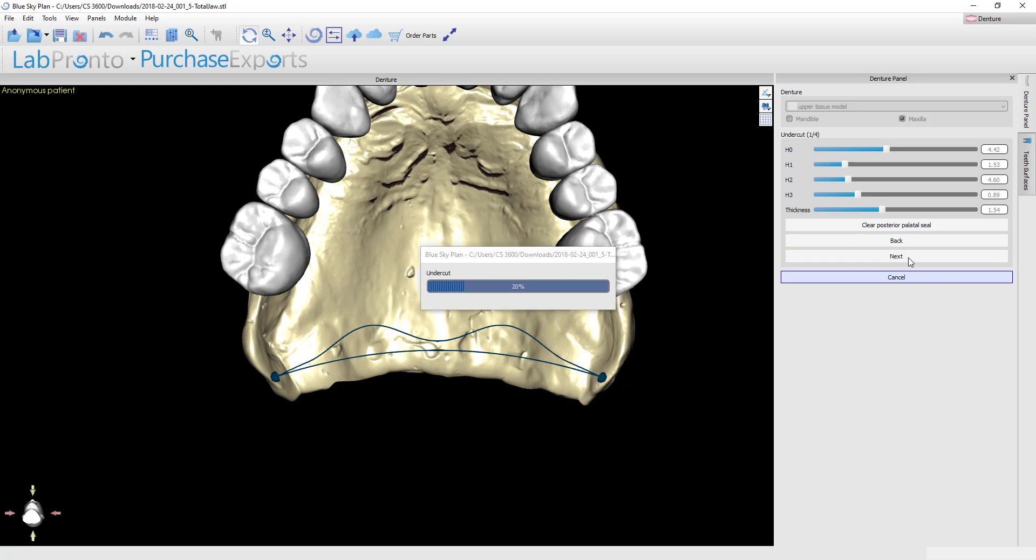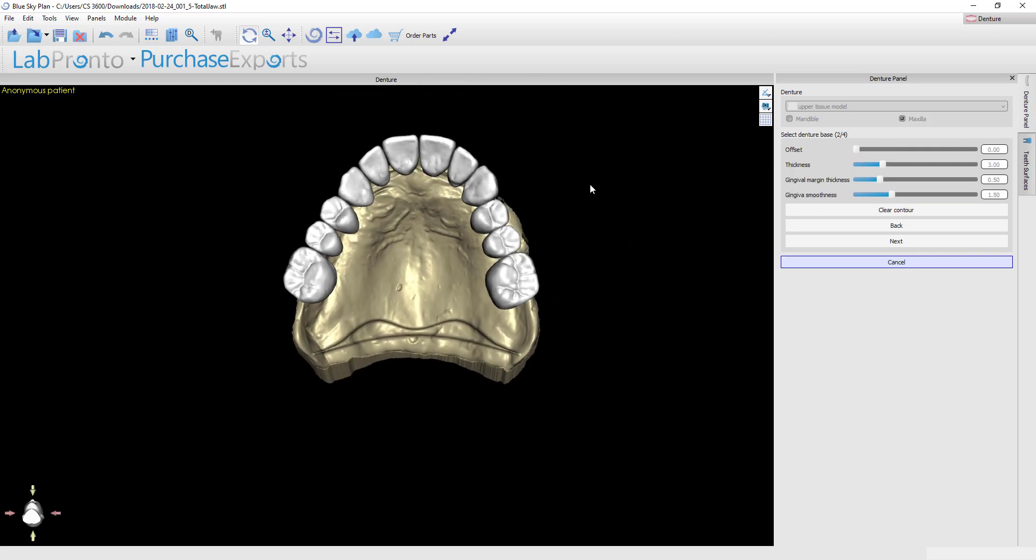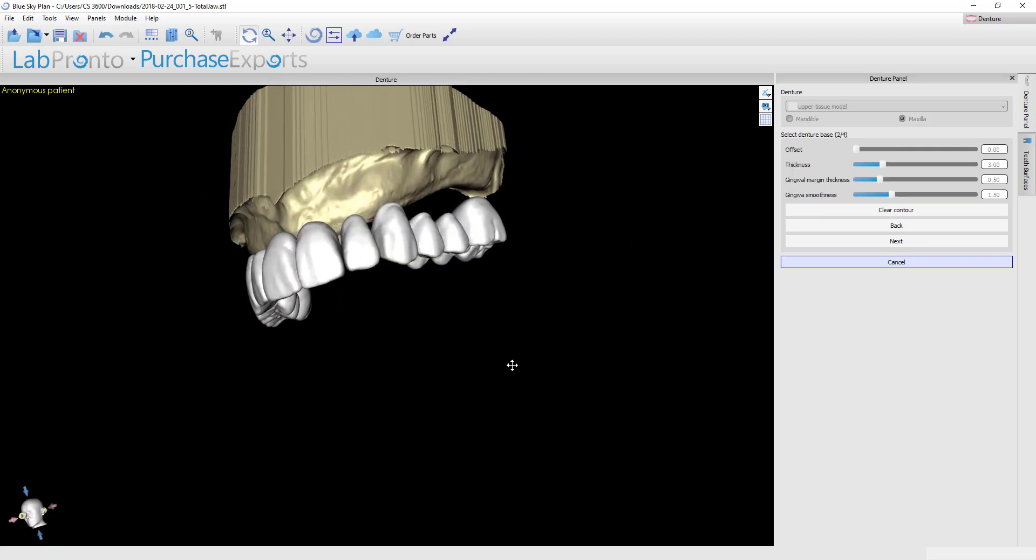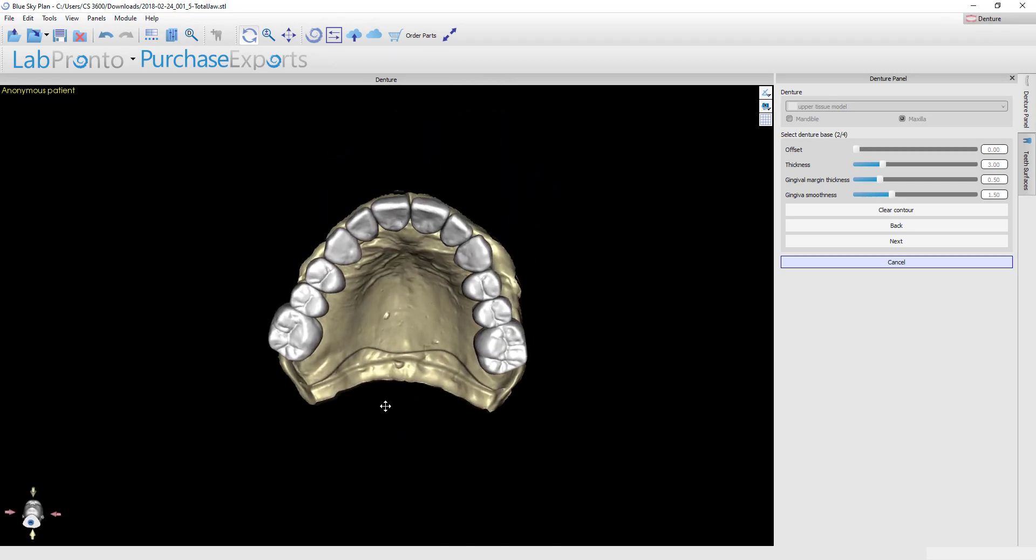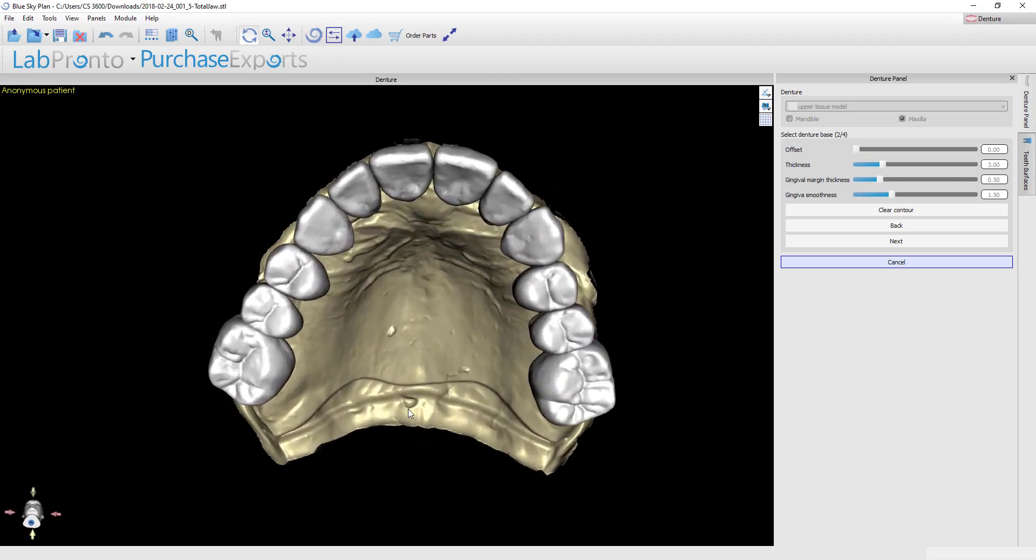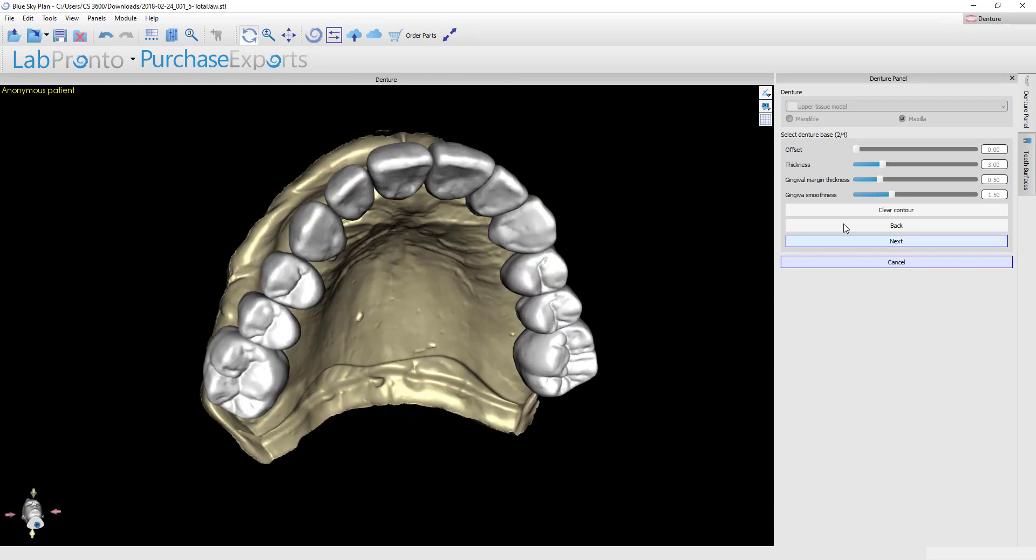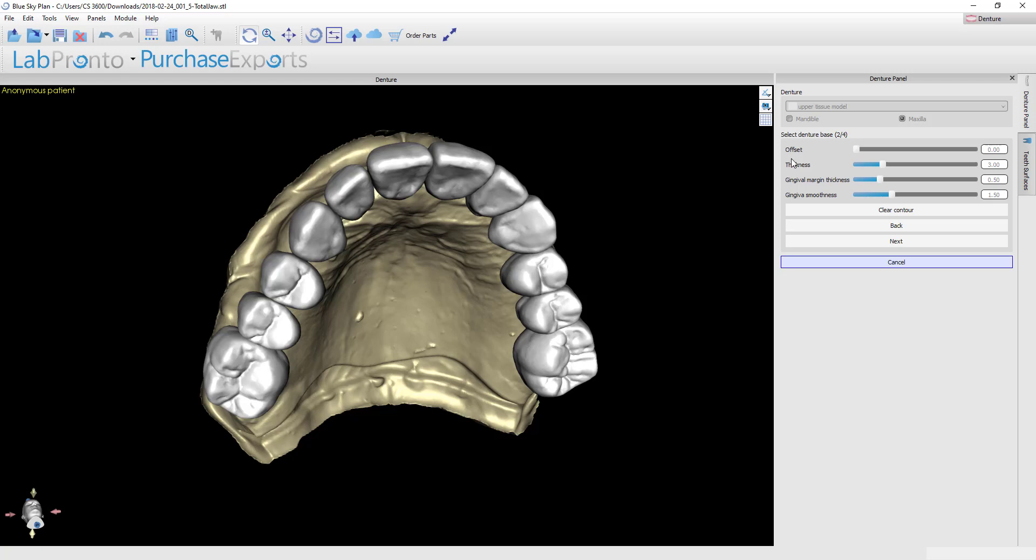In this step, the software is going to create the master model with that cupid's bow built in, and then we can begin drawing the denture base. Here's the resulting master model, and now we're ready to go ahead and draw the denture base. First of all, make sure that your settings are all correct. Offset is the amount of spacer between the denture base and the master model. If you're going to directly mill or print this, then you would want to not have any offset because you want the most precise fit possible.